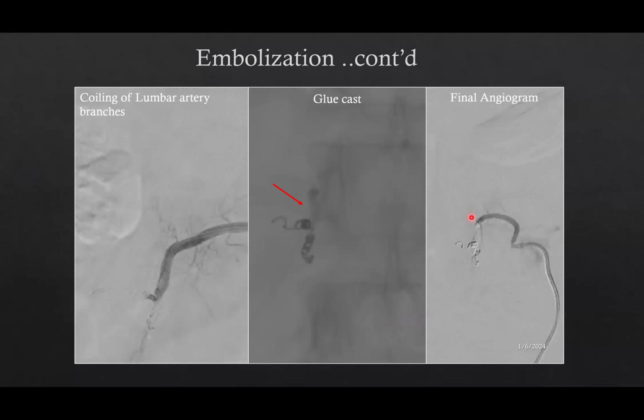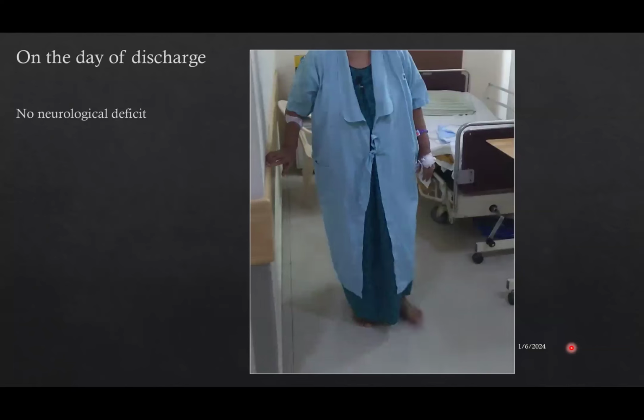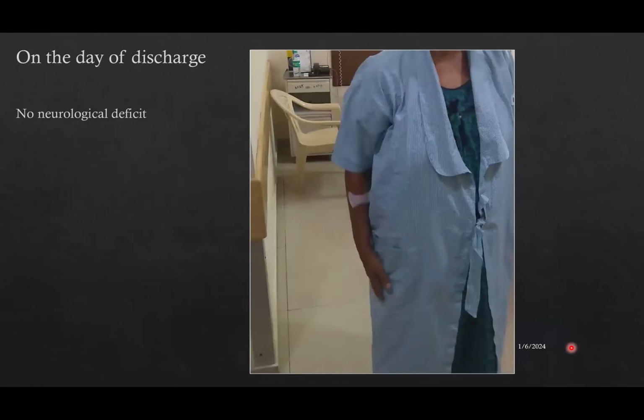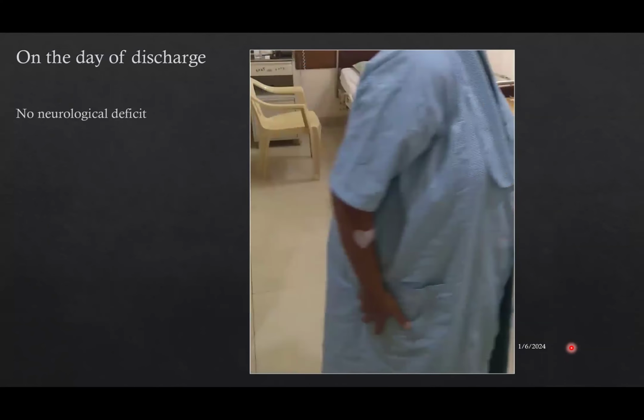The angiogram showed complete occlusion of the artery, and the patient had a good neurological recovery, with follow-up imaging showing resolution of the subarachnoid hemorrhage. She didn't have any recurrence of subarachnoid hemorrhage or any new symptoms on follow-up.